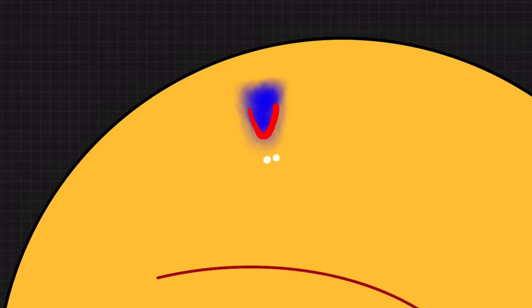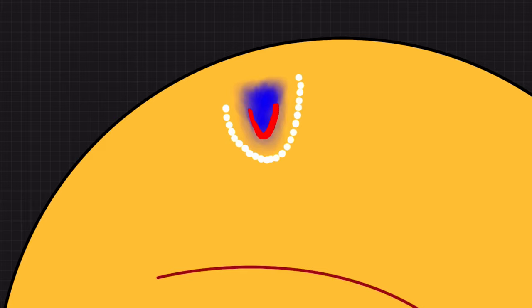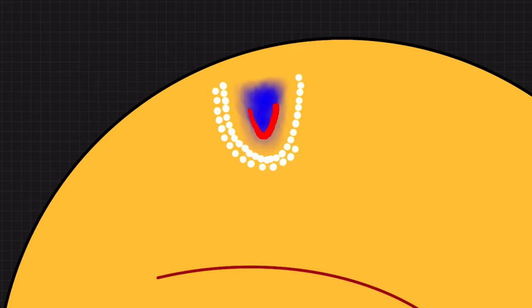Once you're happy with your settings, start at the posterior rim of the tear and create one row of laser spots that are very close to each other. Try to go as far anteriorly as possible. Once you're done with that, create a second or even a third row. This is going to prevent water from flowing underneath the retina towards the posterior pole. This is the easy part—unfortunately, that's where most beginners stop.